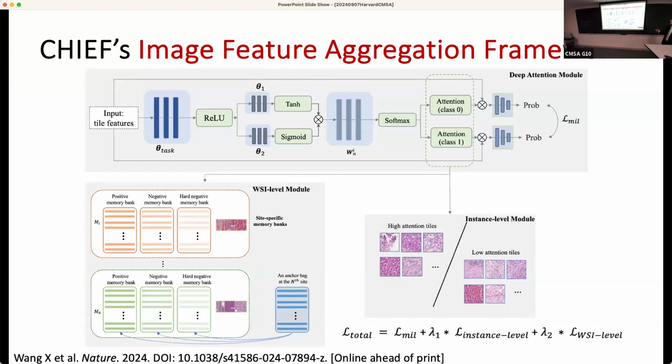So because of that, we are entering a domain where our positive samples would have some regions with cancers, but not every single cell in that particular sample would belong to the cancerous category. But in contrast, if a particular sample is labeled as normal, then every single cell there should be completely normal. So to solve this problem without strong supervision, where we would have to ask a bunch of experts to relabel every single cell for us, here we just look at the sample label annotation, whether this entire sample was labeled as a cancerous sample, meaning that there would be some abnormal cells there, or this entire sample was labeled as completely normal. So with that, we use a pretty standard approach of multi-instance learning to compute the loss function there.